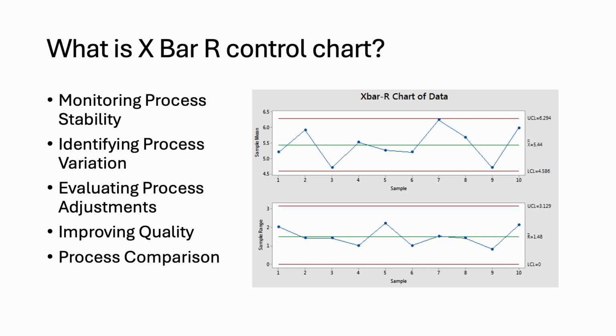Improving quality. Regular use ensures ongoing compliance with laboratory quality standards, reducing the likelihood of errors. As an example, continuous monitoring of complete blood count test results using X bar R charts helps maintain accuracy and precision, ensuring reliable patient diagnostics.